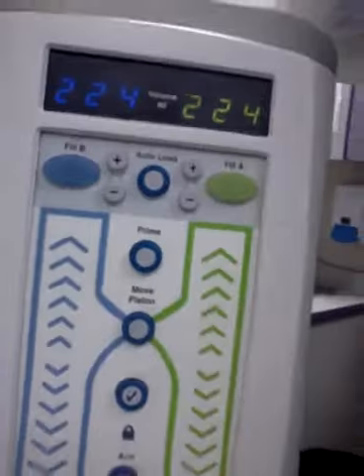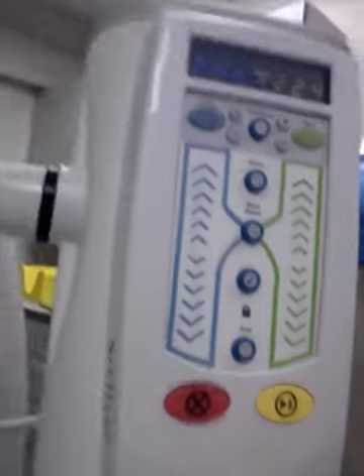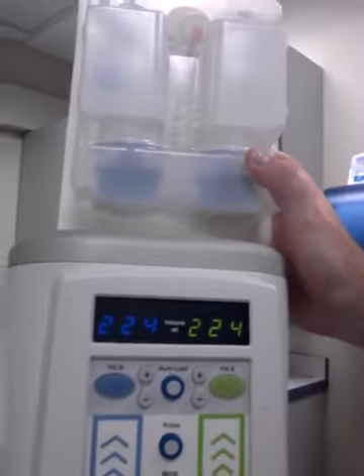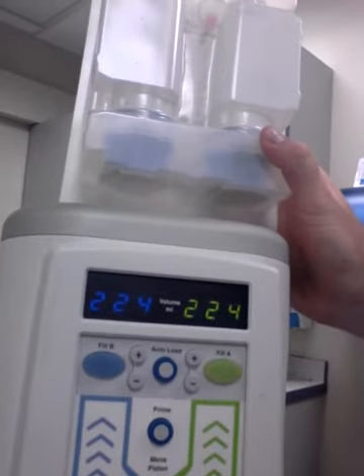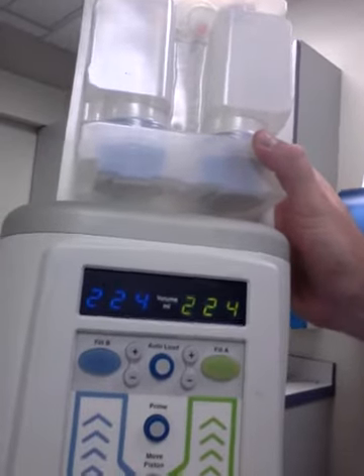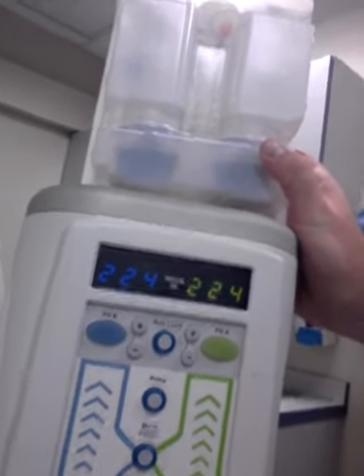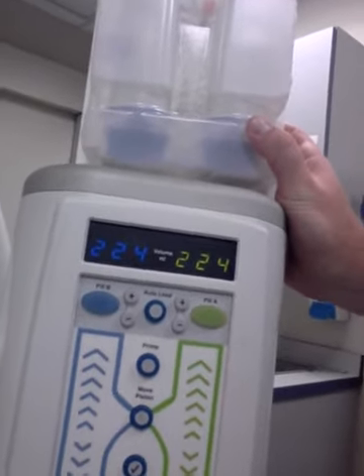So what we would do, we would come over here, we would come to our injector, we would push both of these injectors in, we'd get the tubing on, and we'd get the injector set up ready. We'd get both of our contrast lit up in here. We'd have saline on the blue side and contrast on the green side.